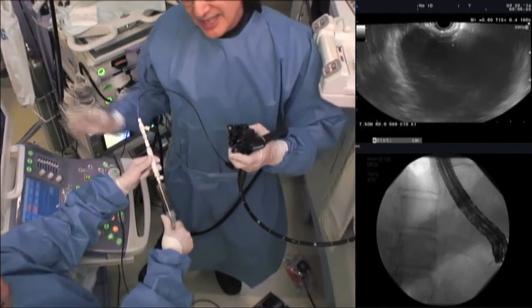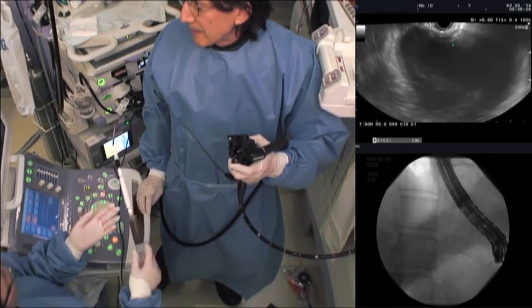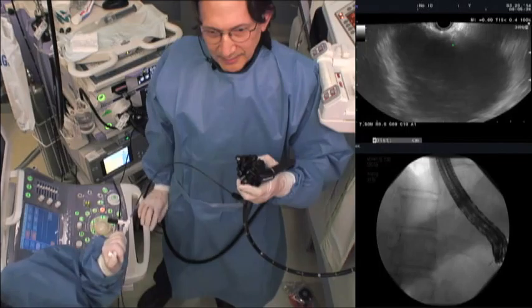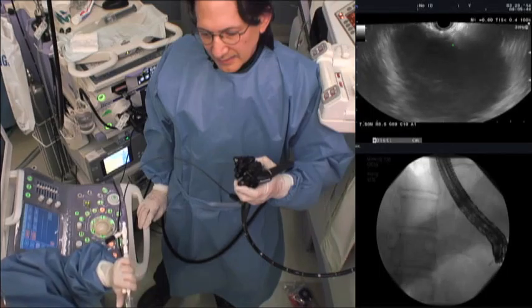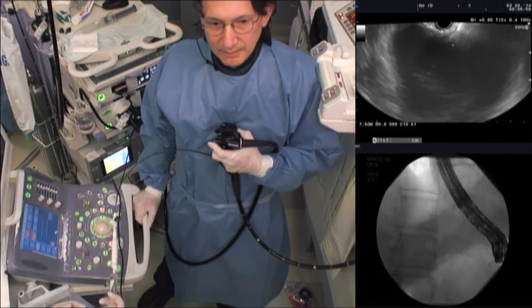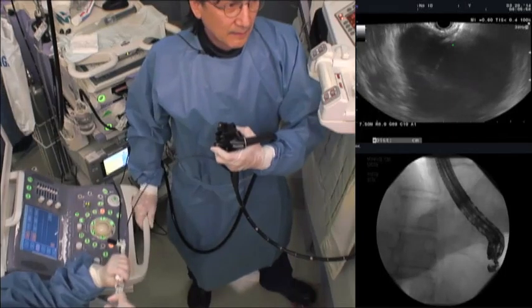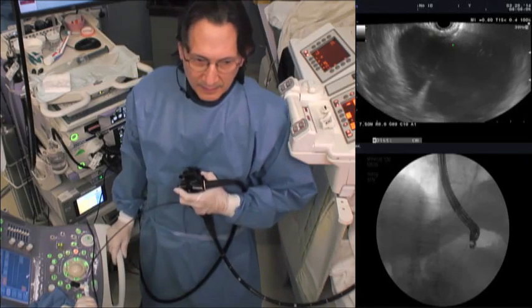Are you guys able to hear me fine? Yeah, go ahead and take it off. And then we're, no, contrast. Go ahead and inject. Okay, stop.